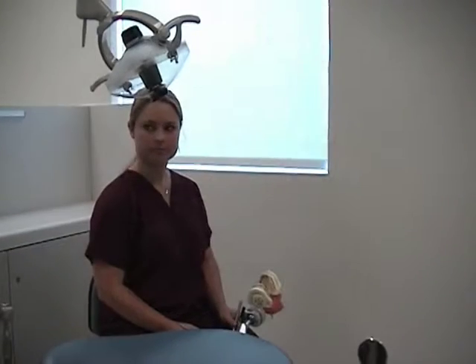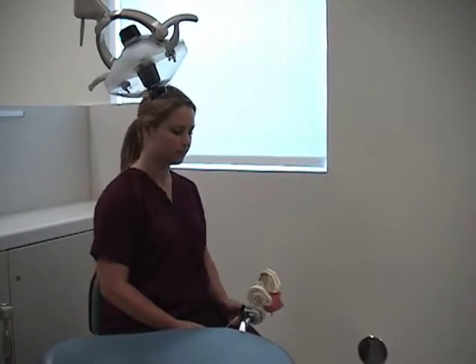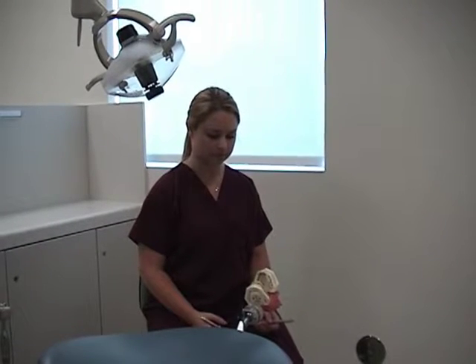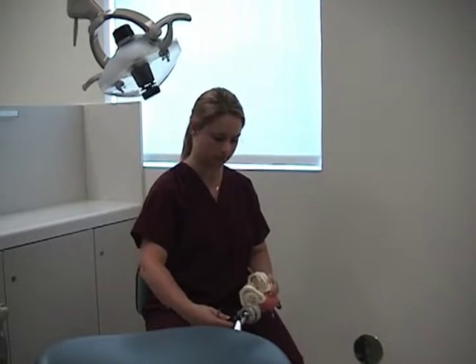Remember, for all instruments: first, assume the clock position for the treatment area. Then, establish the patient chair and head position for the treatment area.